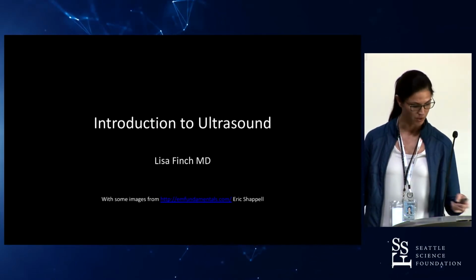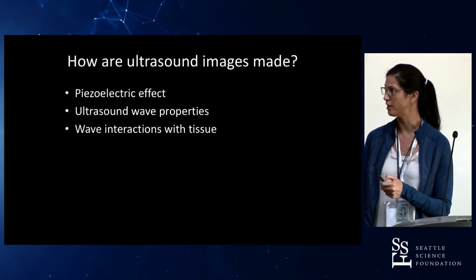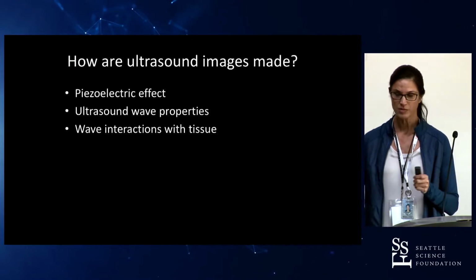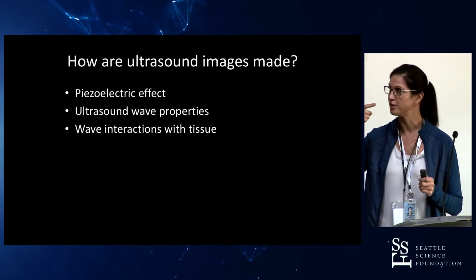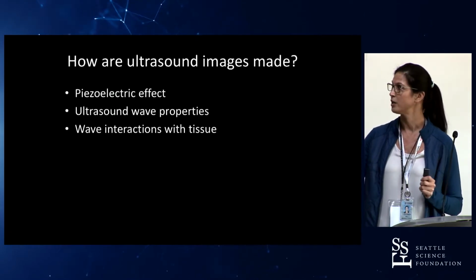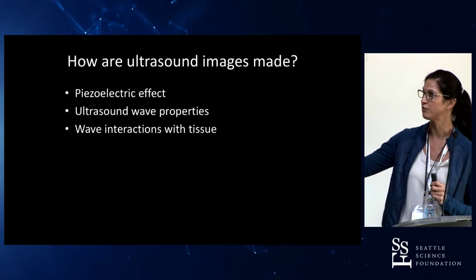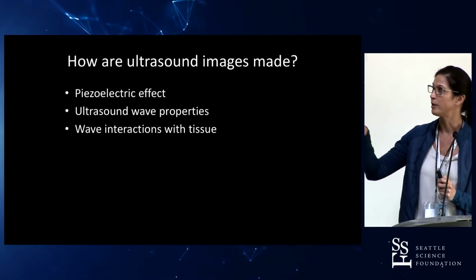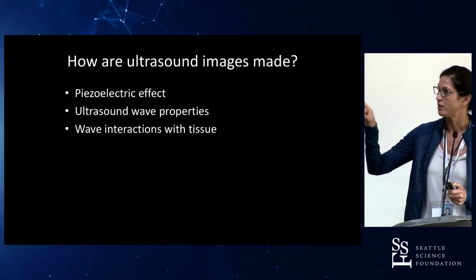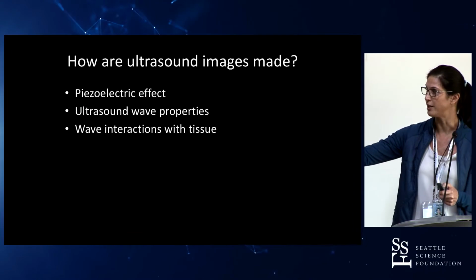So I wanted to give you an idea, and I apologize ahead of time if this is too basic for you, but just to get your mind oriented to how ultrasound images are created, we're going to briefly touch on the piezoelectric effect, which is the foundation for ultrasound. Then we'll talk about ultrasound wave properties and how they interact with tissue. The transducer is essentially our ultrasound camera. It's over on the left side.